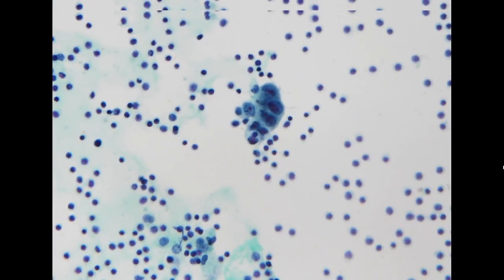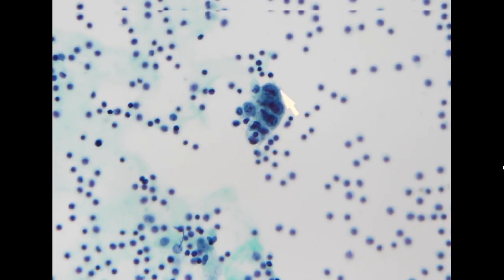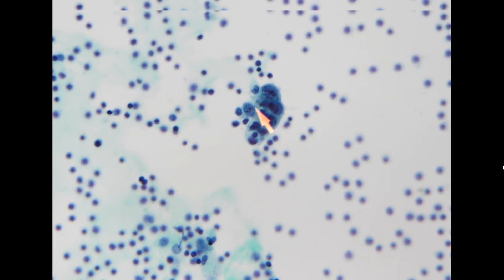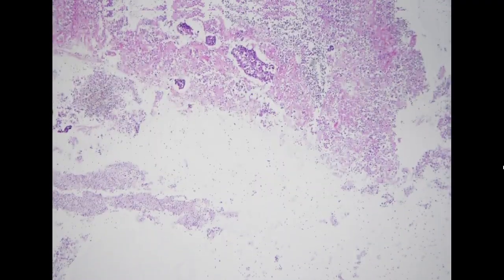Again, in this cluster, you can appreciate a very tight glandular three-dimensional structure with a luminal border. So this is consistent with adenocarcinoma with high-grade nuclear atypia. The history is gastric cancer, but the cytomorphology is not very specific for gastric cancer. We can only tell that this is high-grade adenocarcinoma.